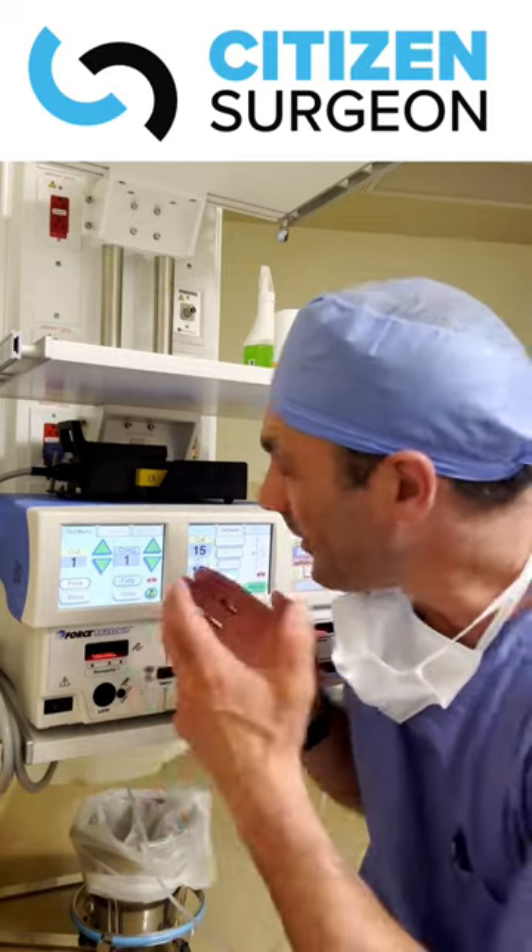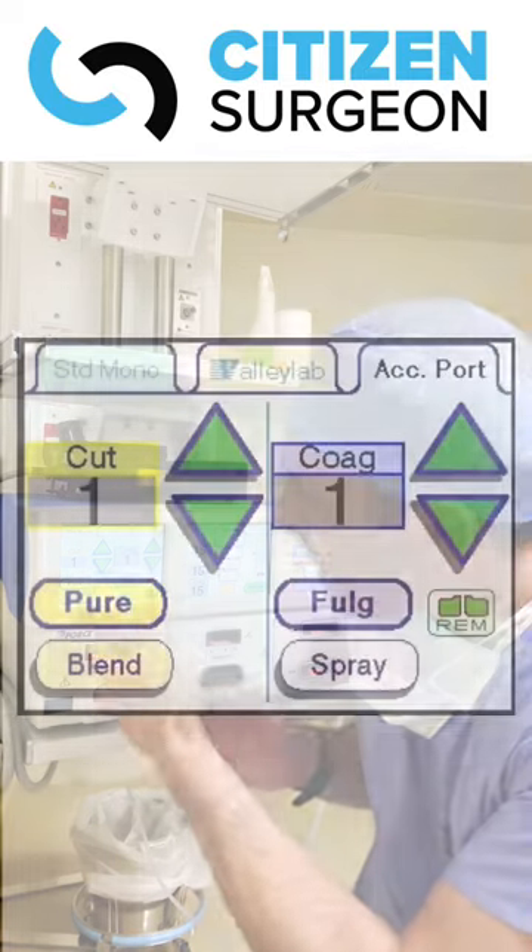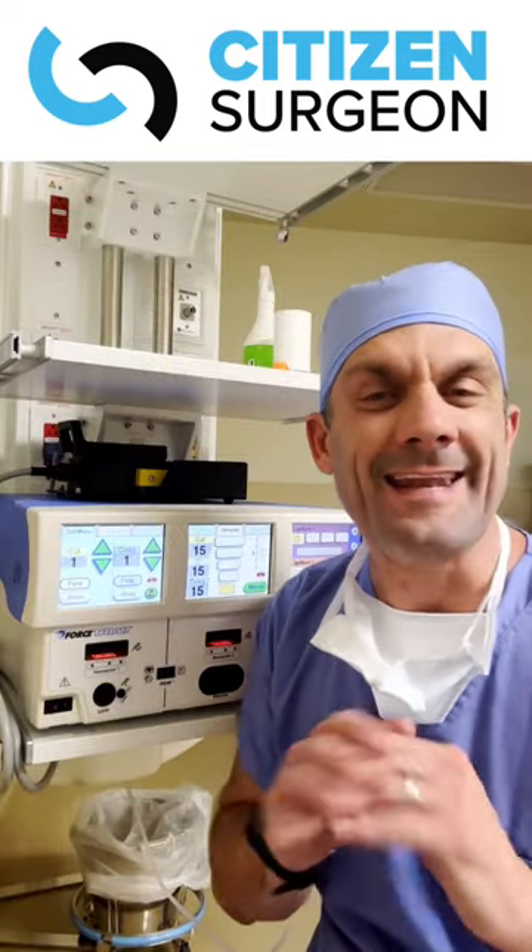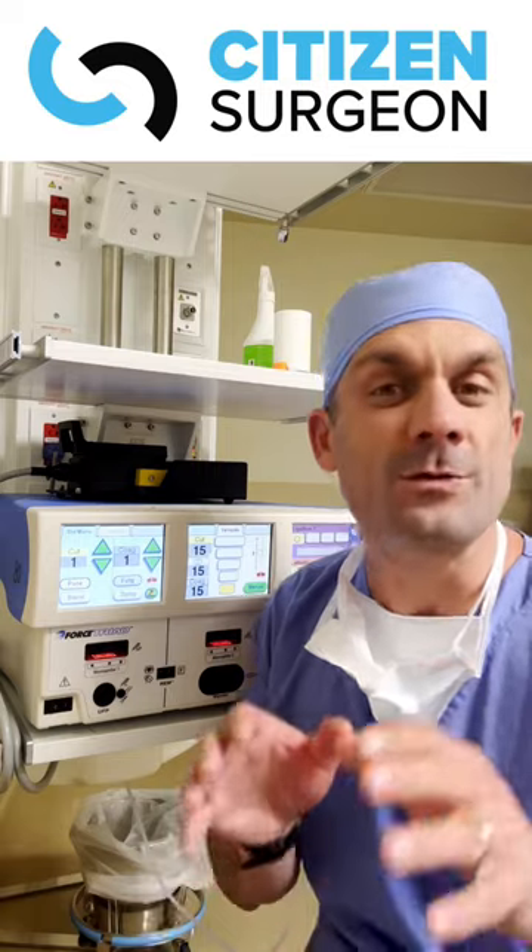When we look at it, there are a few different settings. We have cut mode, we have coag mode. If we want to divide tissues like a scalpel and not have any hemostasis, we would use pure mode.